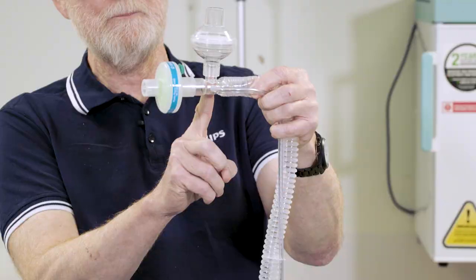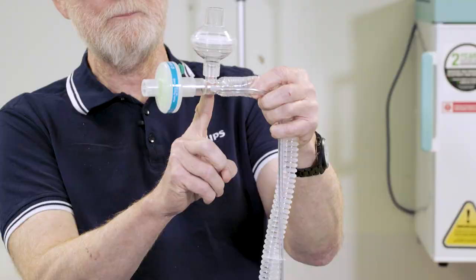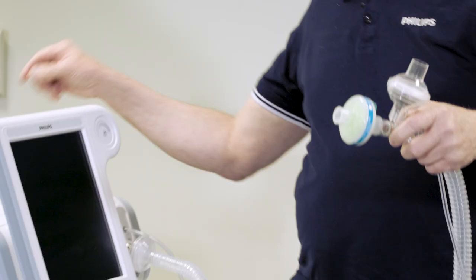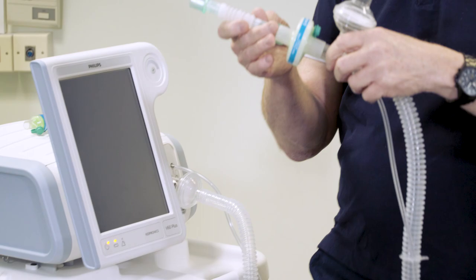Otherwise, you would get potential patient contamination. This can then be connected to the patient — I'm just connecting to an endotracheal tube here on this mannequin.